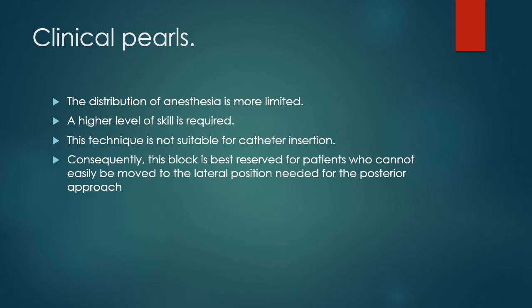The anterior approach is much less clinically applicable than posterior approaches, because the distribution of anesthesia is more limited. A higher level of skill is required.